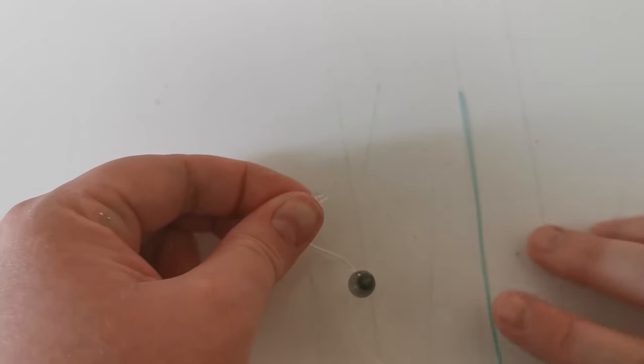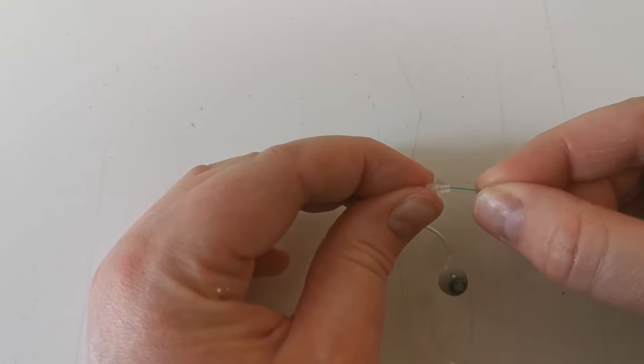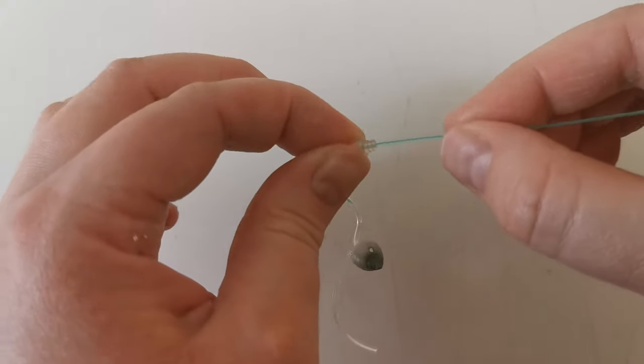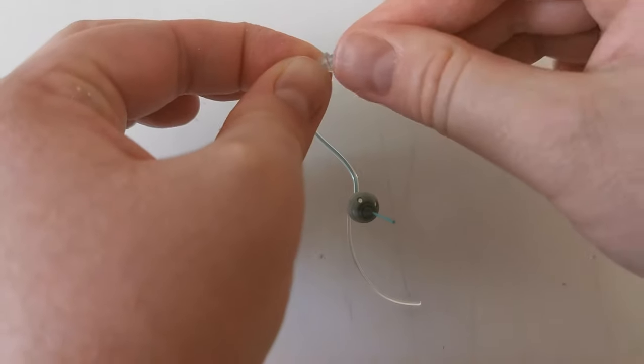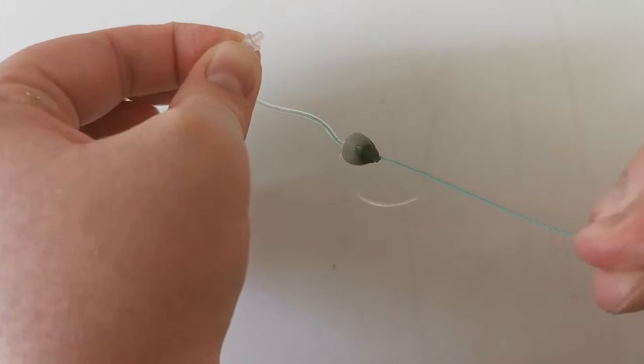You then use the reusable cleaning wire and push it through the end. You keep pushing the wire until it comes out the other side. You then push the wire through the dome.